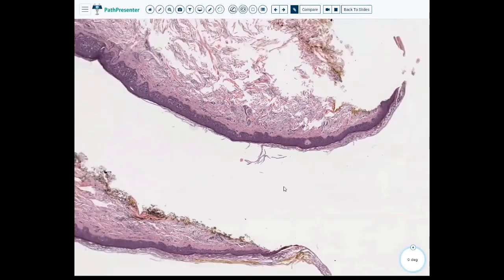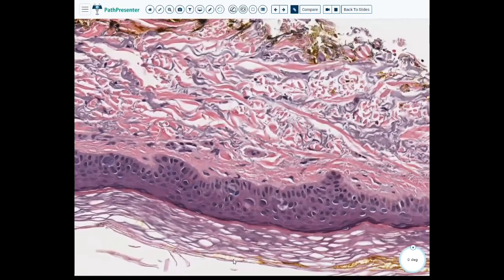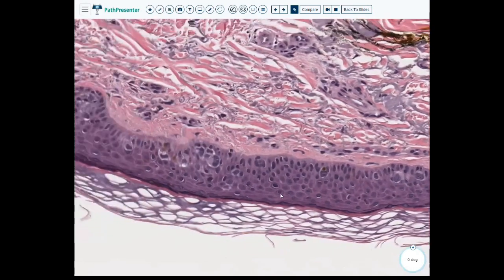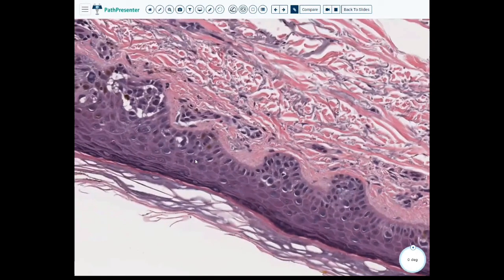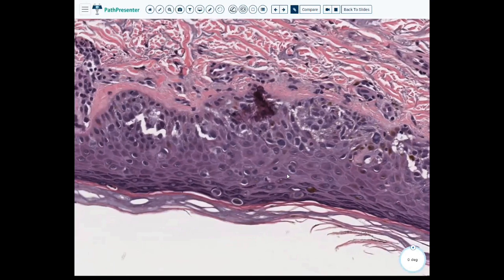Okay, let's take a look at the other piece. But with the superficial spread, like this vertical spread of the melanocytes, see how big some of these are getting? Oh, okay, this is getting scary. There's another one. Oh, okay, this is perfect. So we have these big melanocytes within the basal layers, and then we actually see them right at the superficial layer within the granular layer, or the stratum granulosum.